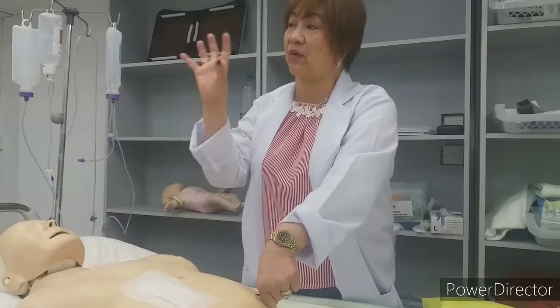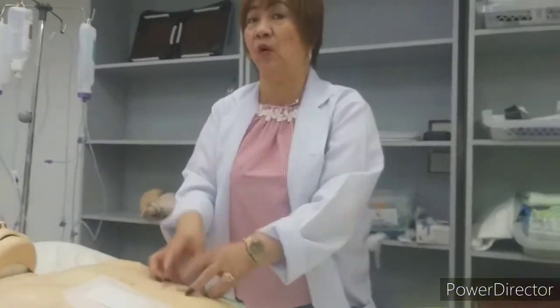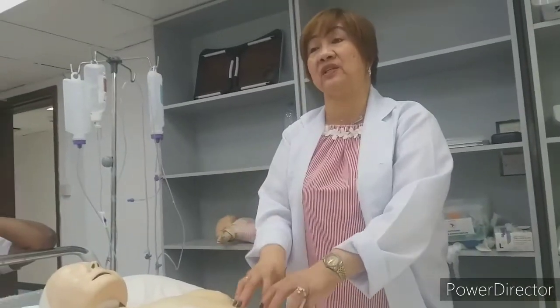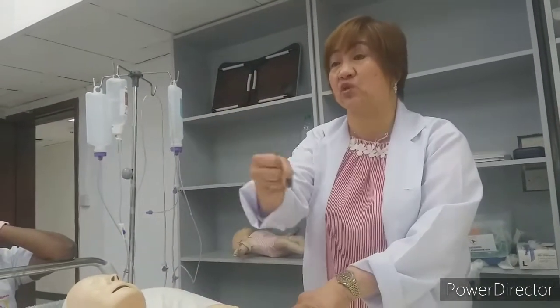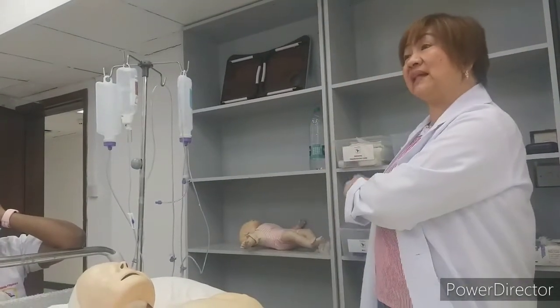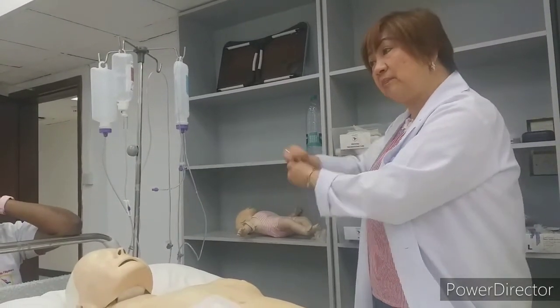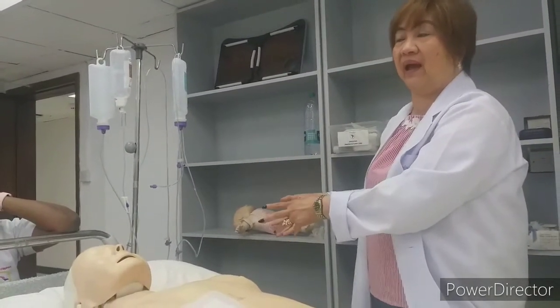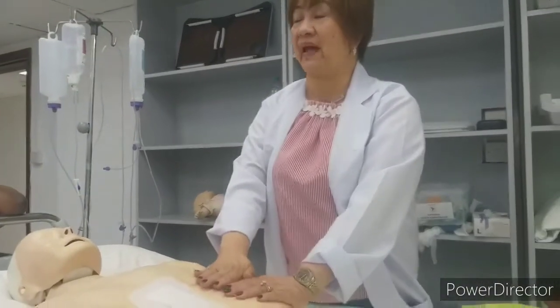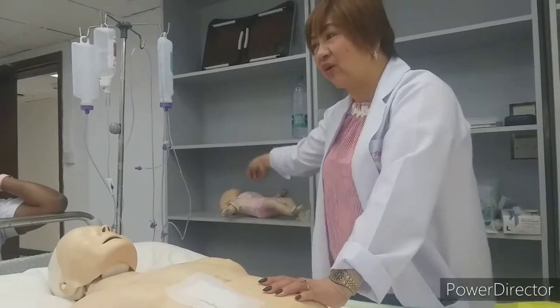One, colostomy bag that is disposable. Automatically, when there is poo-poo inside, especially if your patient is an adult with a big impacted stool, okay? It's heavy. Take it out, throw it to the medical waste, or if there is no medical waste at home, throw it there, but it needs to be put in a plastic bag. If good for the patient, there is a colostomy, disposable, fine, throwing only.